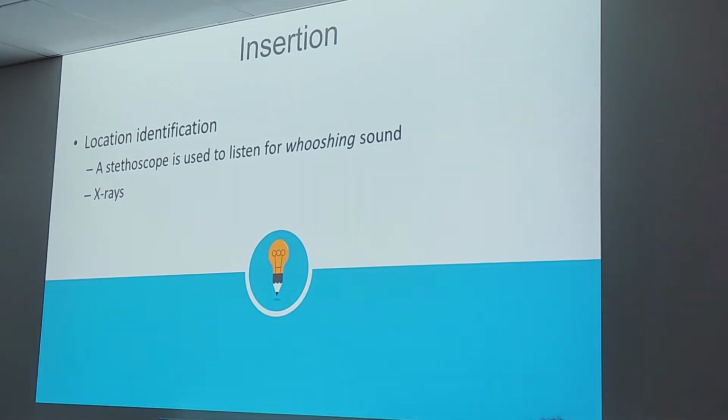Why do you think that is? To help open up our esophagus. Help it move down, but more specifically, protect. You don't want the tube to go down the trachea, correct? And what does swallowing do? Closes the trachea. Correct. So we don't want this patient to aspirate it into the lungs, so that's why they have to swallow. So it goes down the esophagus and down to the stomach. Has it happened before? Oh, yes.